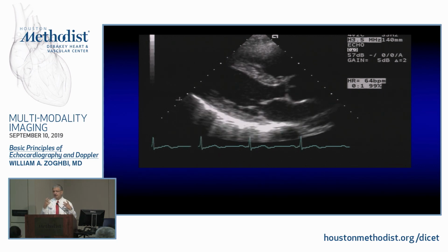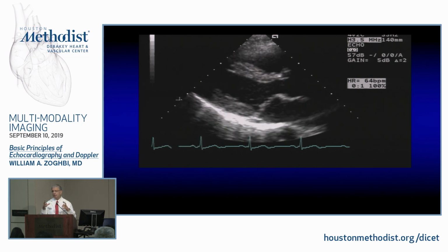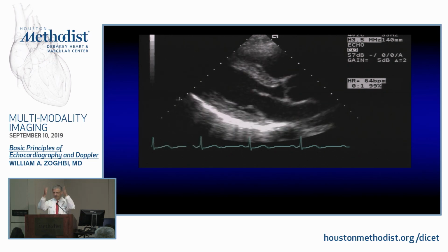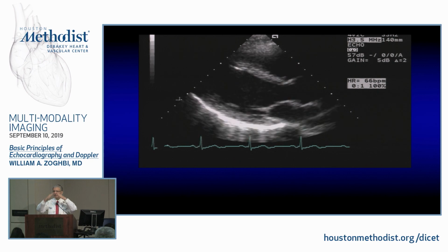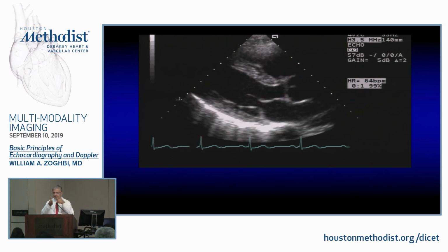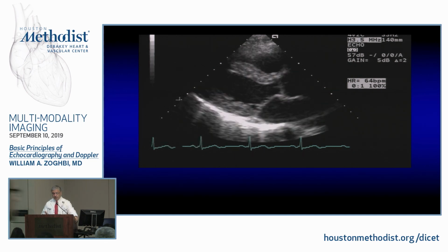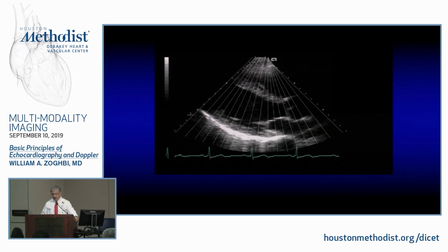The ultrasound of 2D for vasculature or the abdomen is a linear probe, and it's flat, and it goes up and down, so you don't have to have a sector per se for you to be able to see. Here, we're trying to maximize view from between the ribs. Now, how is the image done? The image is actually done through steering, either initially mechanically, not anymore, electronically nowadays.